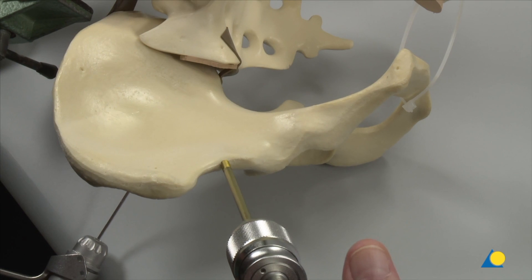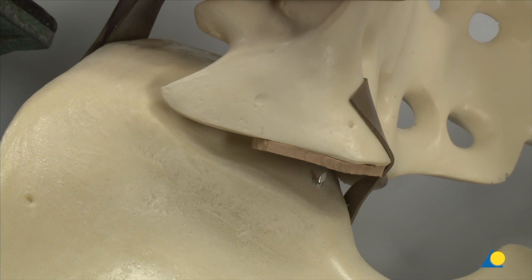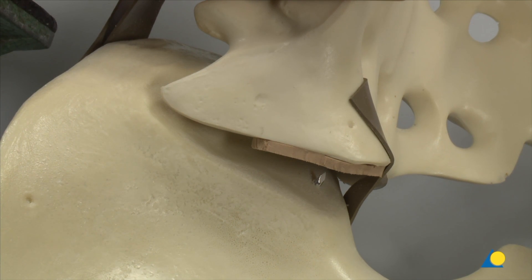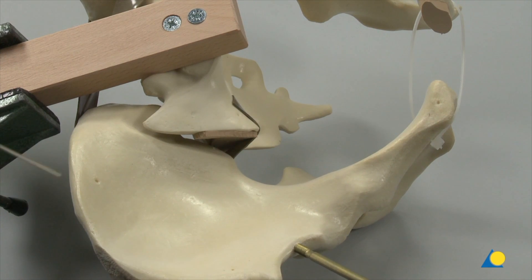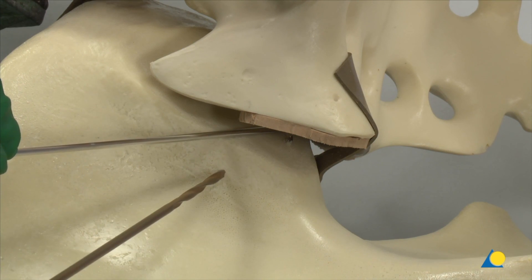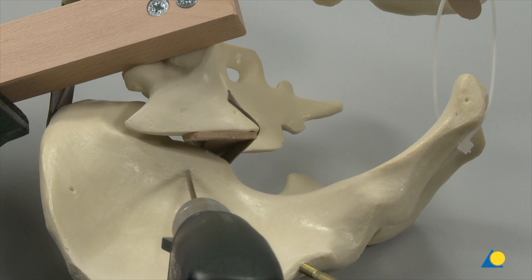Insert a transcutaneous 2.0 or 2.5 mm K-wire for temporary fixation. The tip of the K-wire is visible inside the sacroiliac joint. Make sure the K-wire is not so long that it hinders correct reduction of the joint later. Define the spatial orientation of the sacroiliac joint with the aid of a K-wire positioned inside the joint. Parallel to this K-wire, drill a 2.5 mm hole into the iliac bone close to the sacroiliac joint.